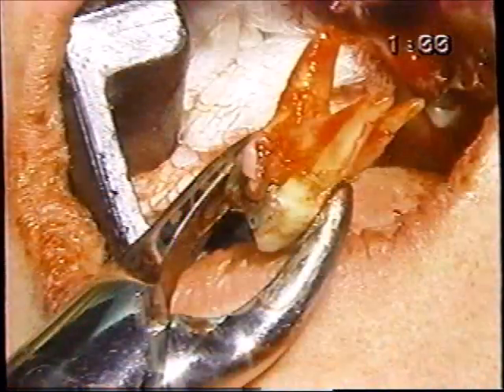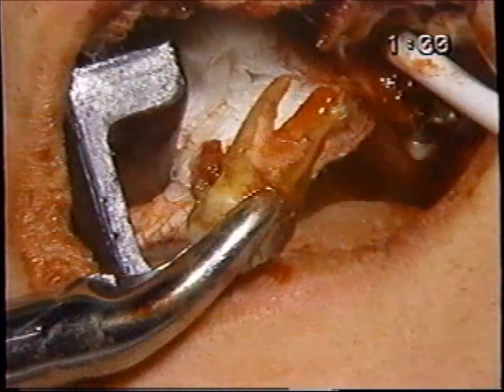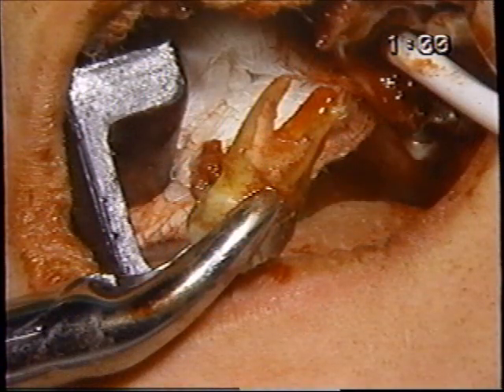And we'll let it come any way it wants. It may mean that some of the facial bone is fractured, but we'll check that. There we have. In fact, we did. There's a little bit of facial bone, as you can see there.